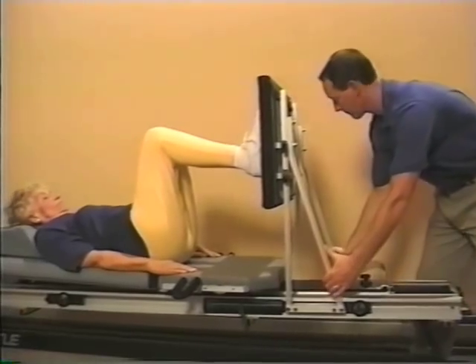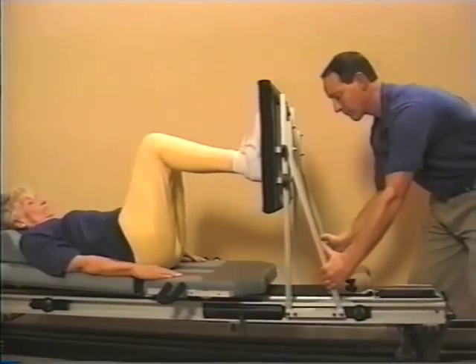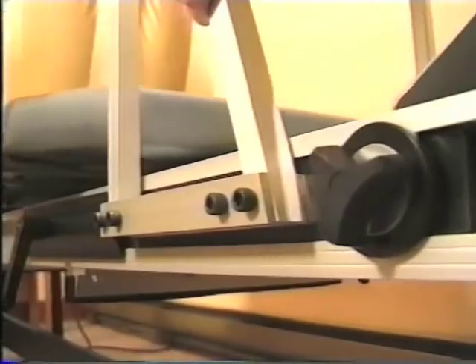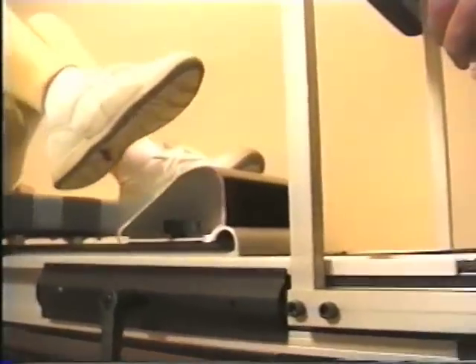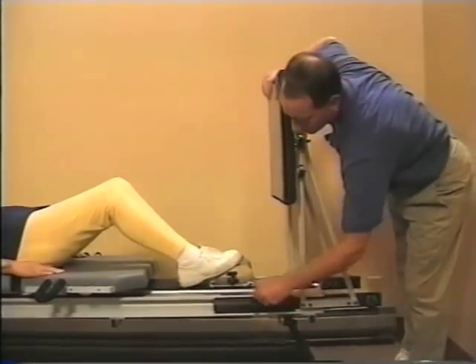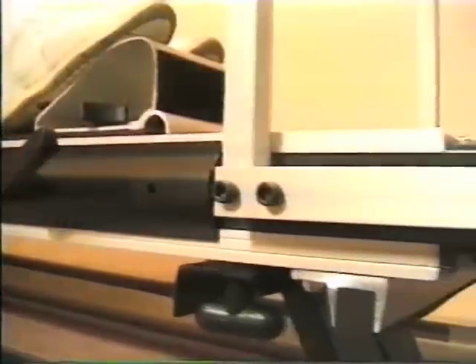Both flexion and extension can be controlled when doing strengthening activities on the shuttle. By sliding the platform forward toward the patient, flexion is increased, and conversely, sliding the platform away decreases flexion. These elongated bars, unique to the shuttle, allow you to easily pull the kick plate all the way to the end to accommodate very tall individuals and still securely lock the kick plate into place.